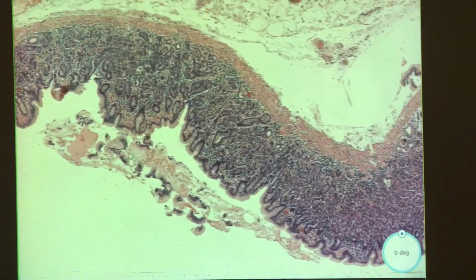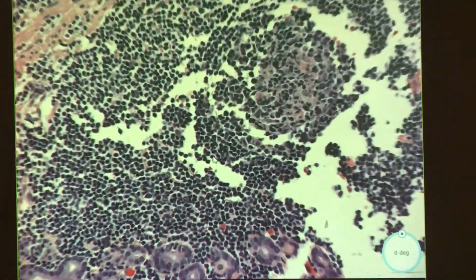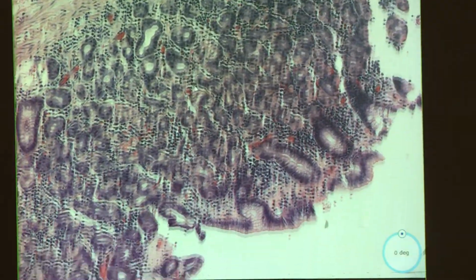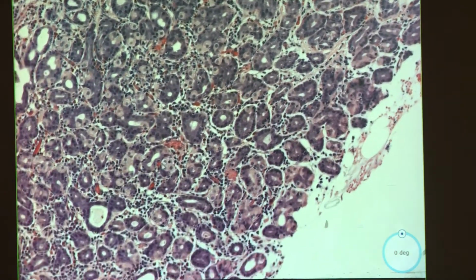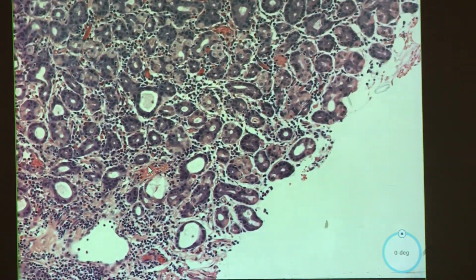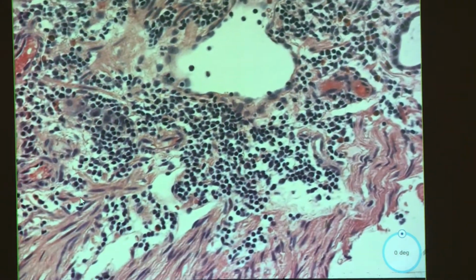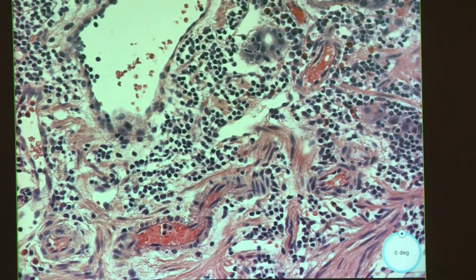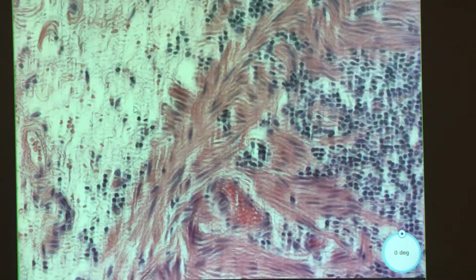Yep. I mean, to be honest, autoimmune gastritis is something that I kind of struggle with myself. But I think this probably falls within the realm of early phase, just because there's so much inflammation. But really what helps draw you from thinking, is this another H. pylori, do I need to run the stains, are the Eos and the scattered mast cells. I don't think there's a lot of them, but okay.